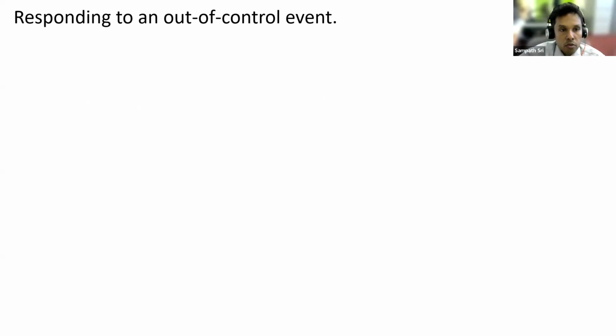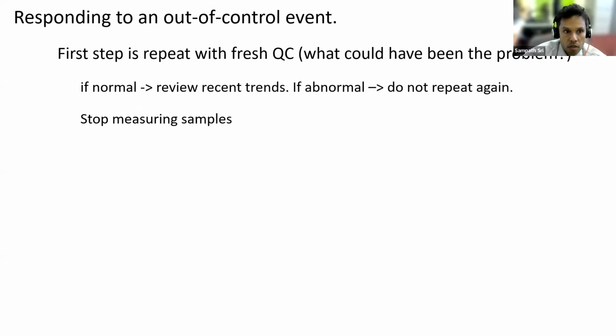So what do we do if we see one of these rejection rules? The first thing is to repeat the test with fresh QC.